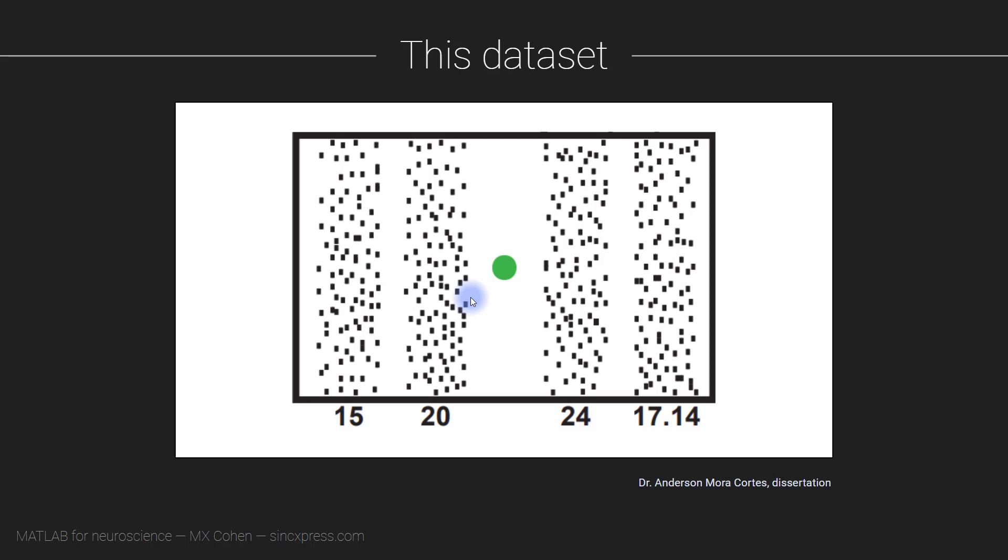These are EEG data collected during an SSVEP experiment that was done by a PhD student in my lab. So in this experiment, the research participant was looking at a dot in the center of a computer screen, and there were four columns of smaller dots. And each of these columns or each of these dots were all flickering at different rates.